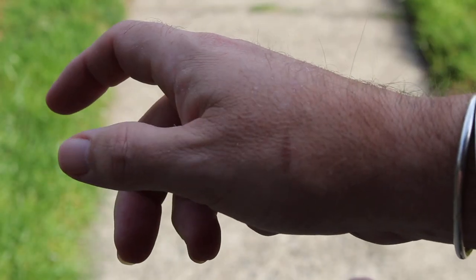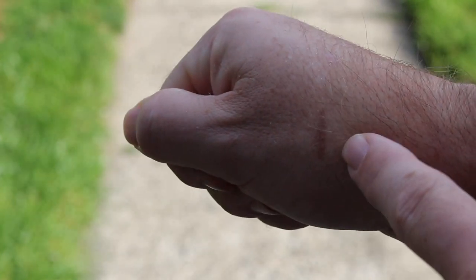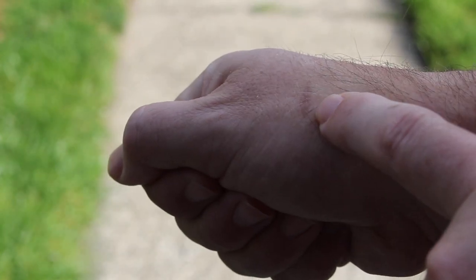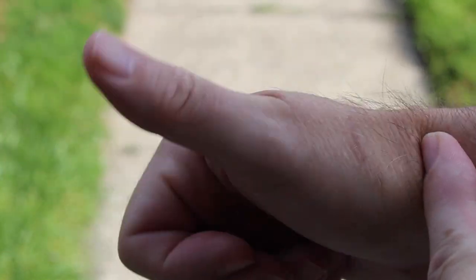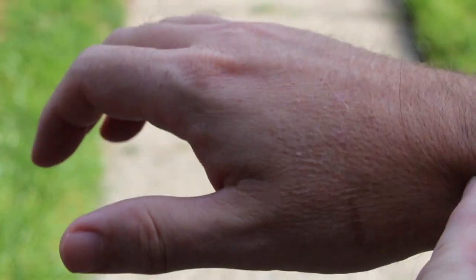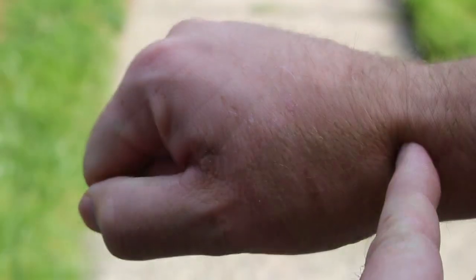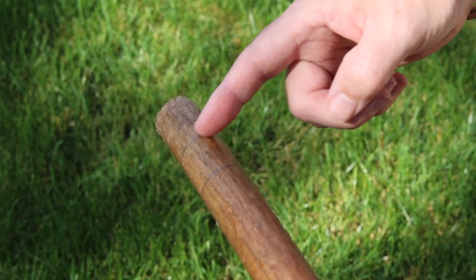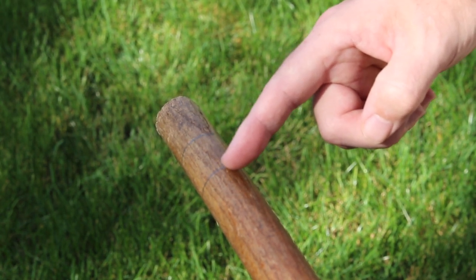I'm not a hand model, but where we're measuring to is not the oven rack burn from making the apple pie — it's to this point, the bend in the wrist, right where the thumb terminates. That's where we're going to measure to for the cane. I've marked the cane where I'm going to cut it off and also where I'm going to notch it so that the rubber tip sits in seamlessly.